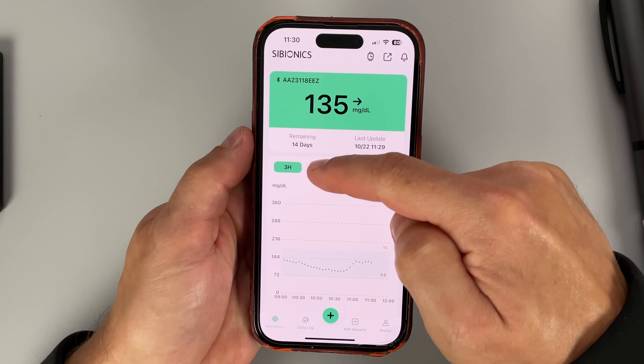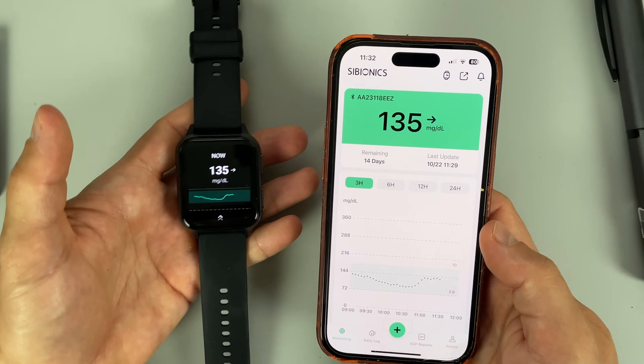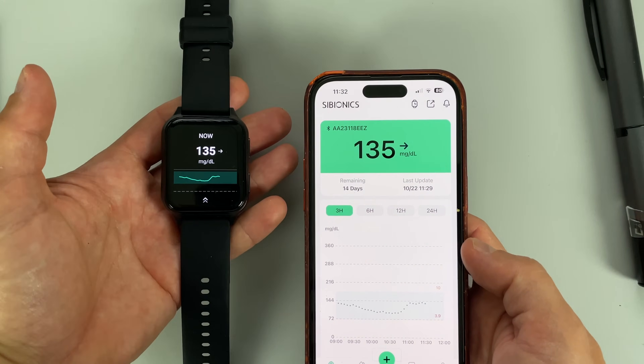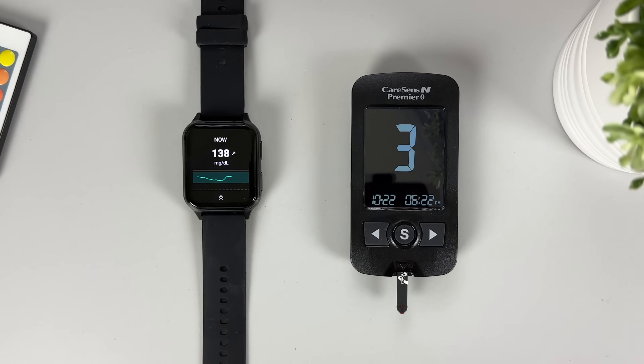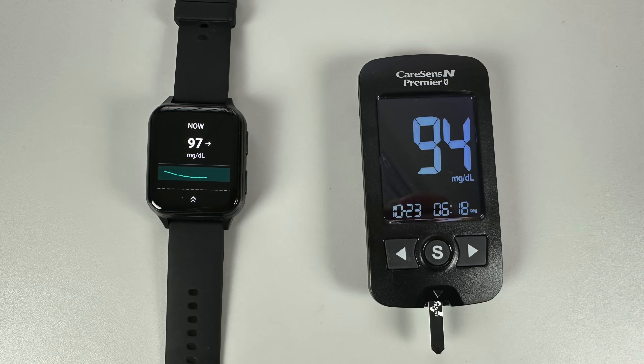The glucose readings can be displayed on the mobile phone as well, whether it's an iPhone or an Android phone. But the main benefit of this system, at least for me, is the direct-to-watch connection and the glucose readings available 24/7 on my wrist. I did a number of finger pricks to check the accuracy of the CGM readings using a conventional glucometer, and as you can see on the screen, they were all reasonably close, so accuracy was not an issue. I really enjoyed leaving my phone at home and still being able to see my glucose readings and get alarms in case I go low or high.